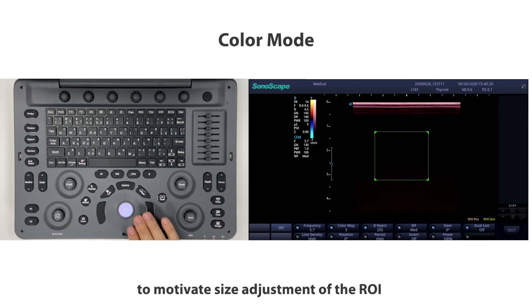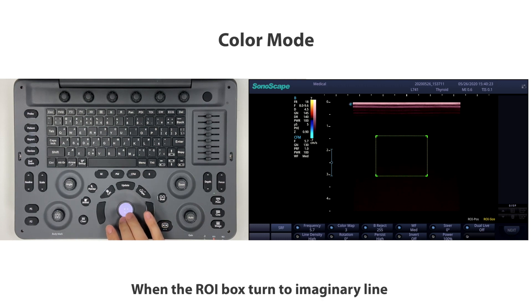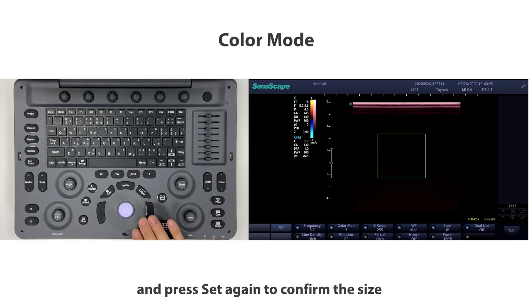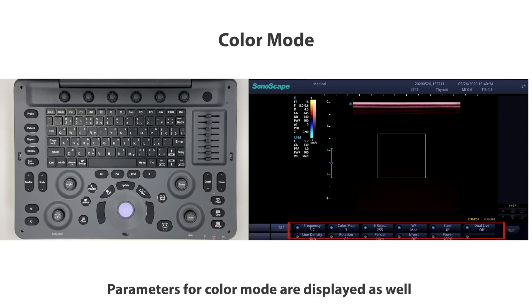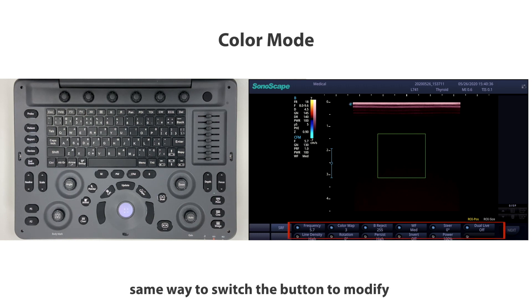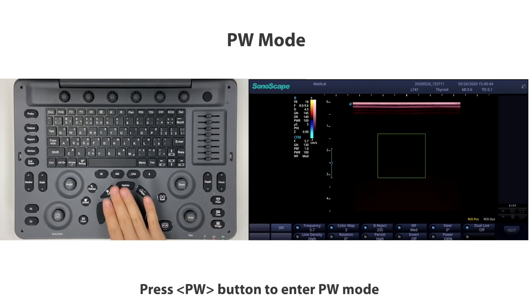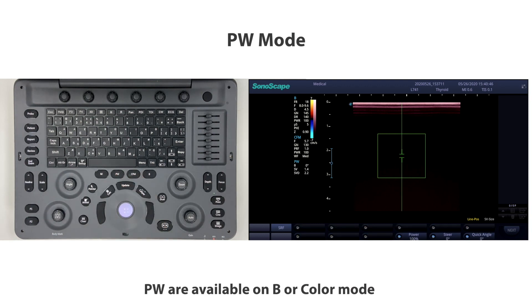Move the trackball to change the position of the ROI box and press Set beside the trackball to activate size adjustment. When the ROI box turns to a dashed line, move the trackball to adjust the size and press Set again to confirm. Parameters for color mode are displayed in the same way — switch the button to modify.